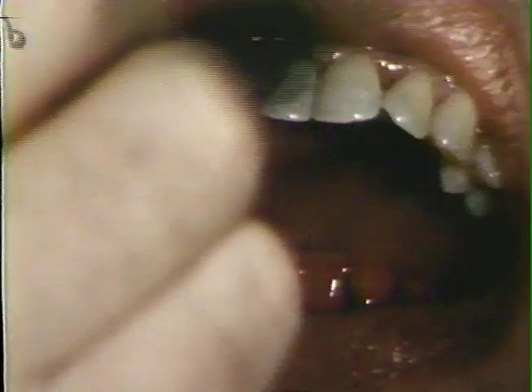After polishing has been completed, a disclosing solution is applied to the teeth. This will reveal any residual plaque and surface stainable areas of decalcification. The solution is applied to the mandibular teeth first to avoid dilution with saliva. Then it is applied to the maxillary teeth.